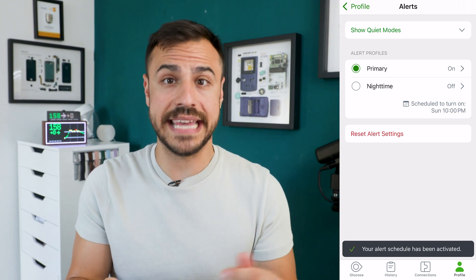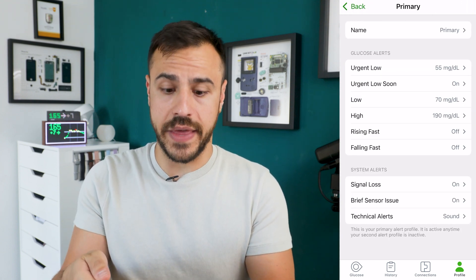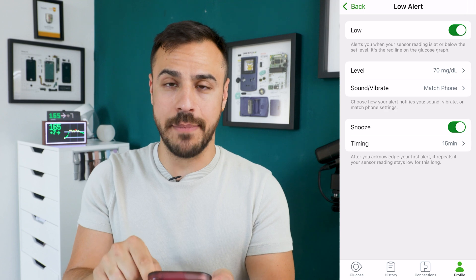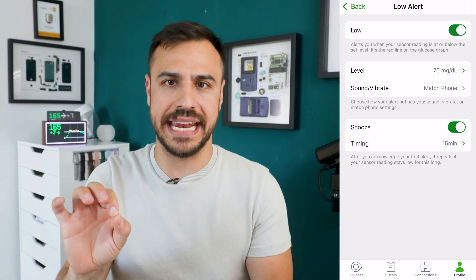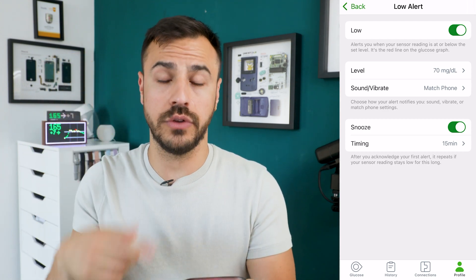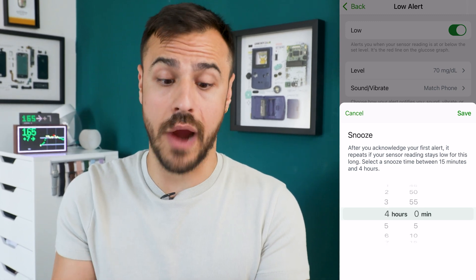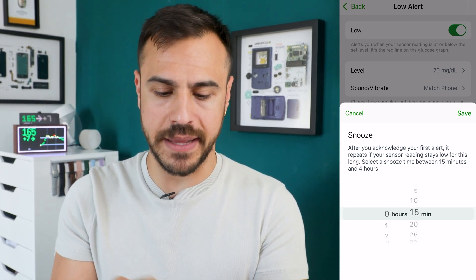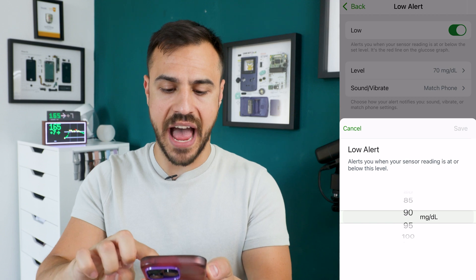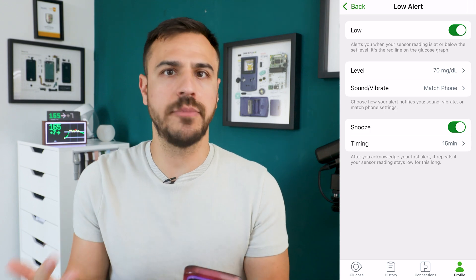Let me dive a little deeper into the settings you can set on these profiles — I'll go into my primary profile. For lows, I have the threshold at 70. What I like is I have snooze on, so you can set it so that when you get an alert, you acknowledge it and you won't get another alert for a declared amount of time. I have 15 minutes — you can do up to four hours. The level of the low, you can change; I have it set to 70. I like getting a little more advanced notice for my lows.